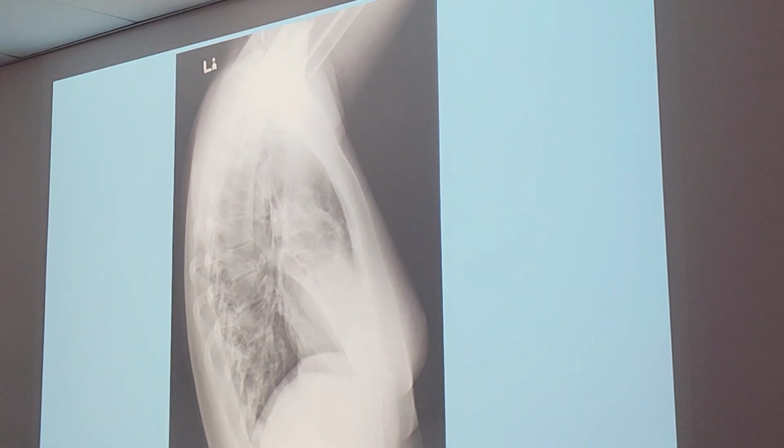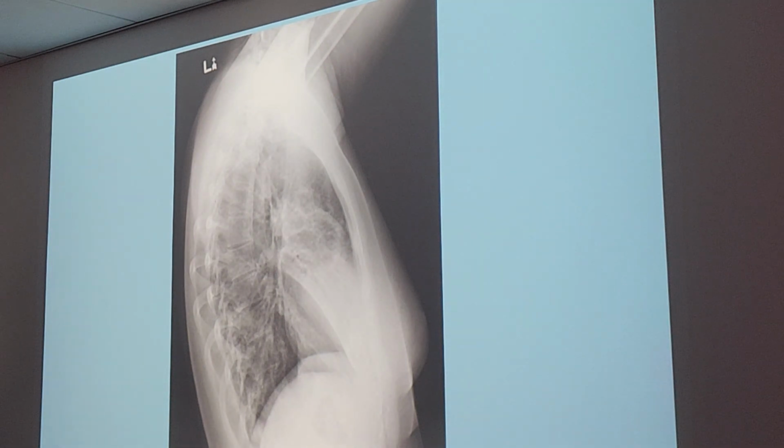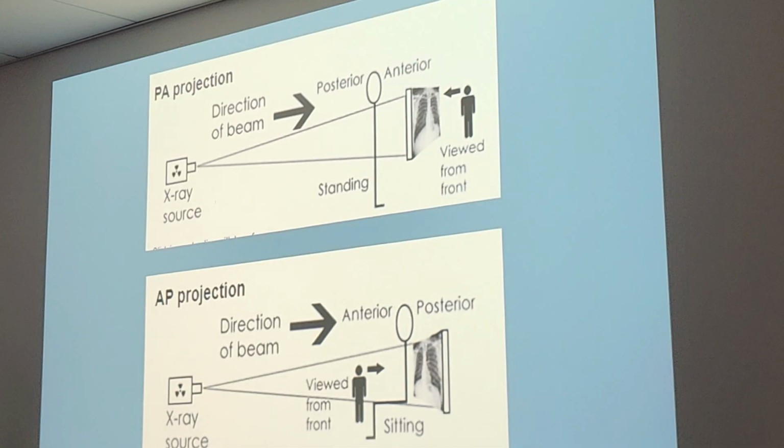That's the arm. Oh, that's the humerus. That's a real bad fracture. Yes, that's the arm, and that is okay to see. It's not okay because that should be collimated out of the way, unless your patient can't stand for too long or hold up their arms for too long. I already gave up. I'm working on a t-shirt.